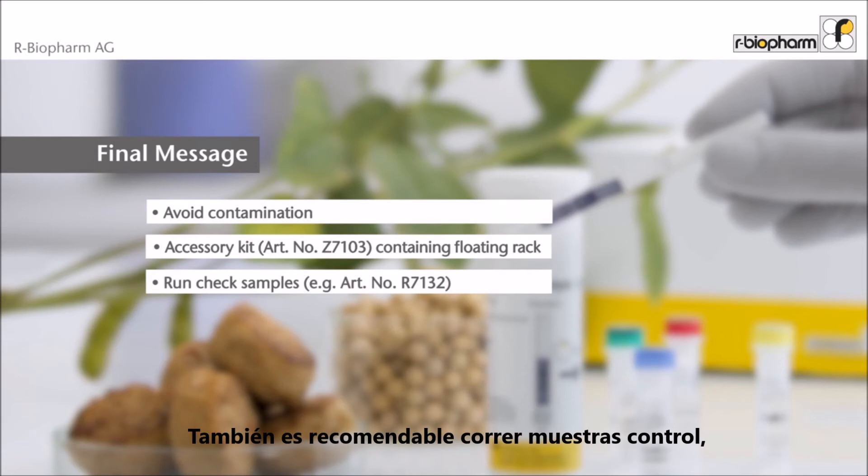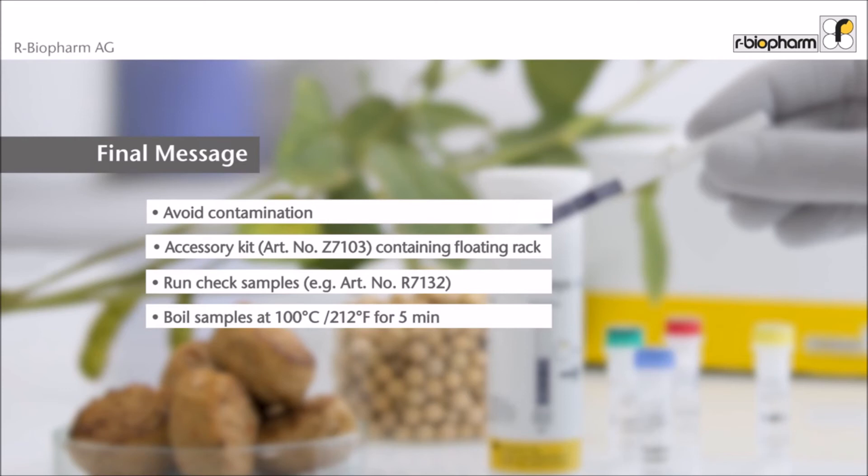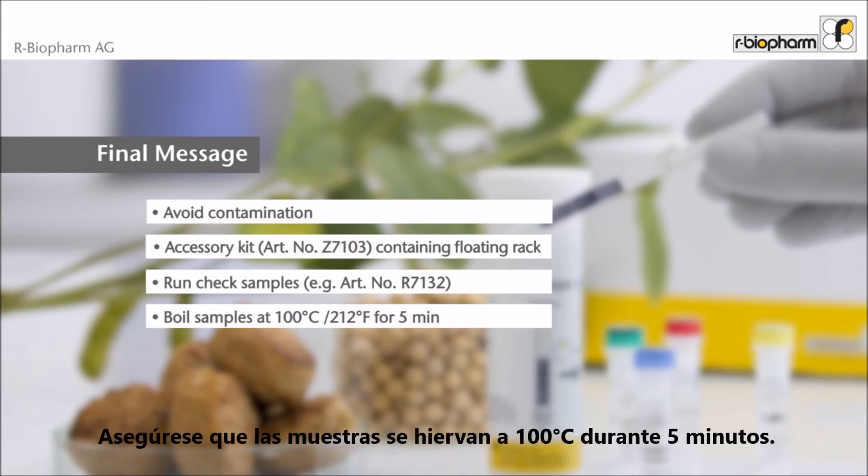It is recommended to also run check samples, for example R7132 — the set of three processed soya assay controls with known concentrations for quality control. Make sure that the samples are boiled at 100 degrees centigrade for five minutes.